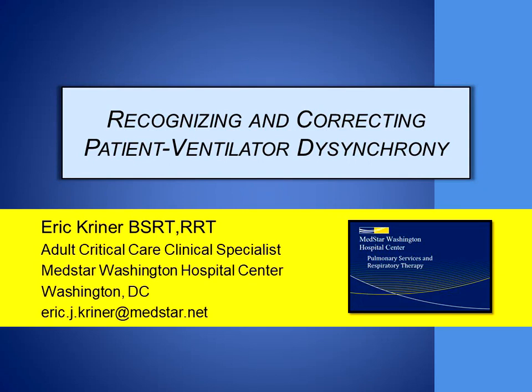Sure. Okay. Thank you so much, Eric. This has been really great. We do have a really great question from one of our attendees. They ask, when discussing flow asynchrony, you mentioned changing the inspiratory flow or inspiratory time. Have you considered changing from volume control to pressure-limited ventilation, which would allow the patient to determine their own flow on a per-breath basis? Absolutely.